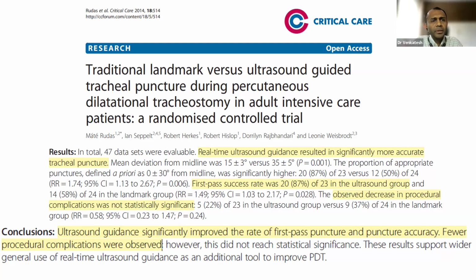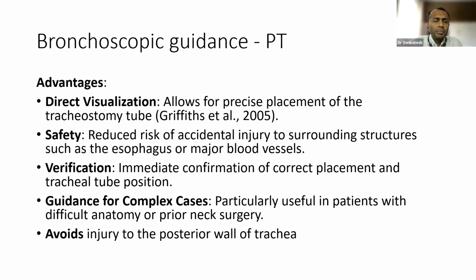And you may all be aware, it's essentially used for percutaneous tracheostomy. The advantages are direct visualization, and while you are positioning the tracheostomy tube, you'll be able to see. Hence it reduces the risk of accidental injury to the surrounding structures. Bronchoscopy also gives good guidance for complex cases, especially difficult anatomy or prior neck surgery patients. It also avoids injury to the posterior wall of the trachea.